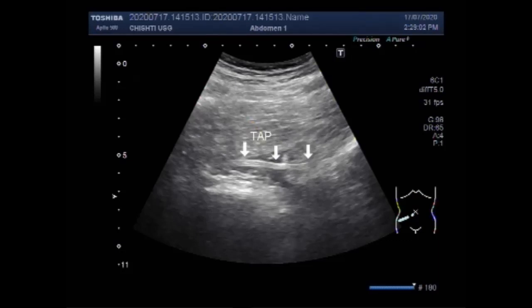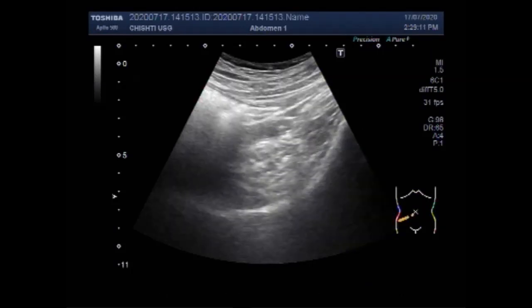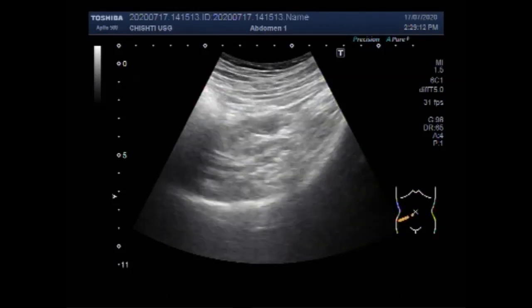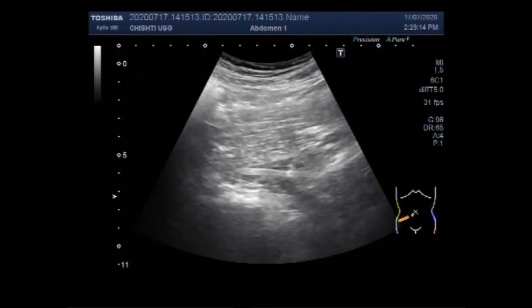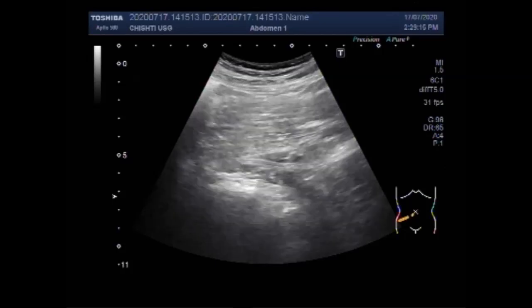Now you can see the tapeworm. The full length of this worm could not be visualized and could not be focused.